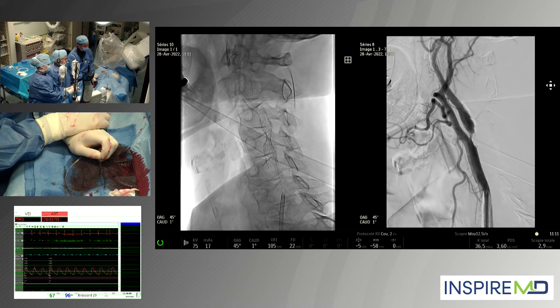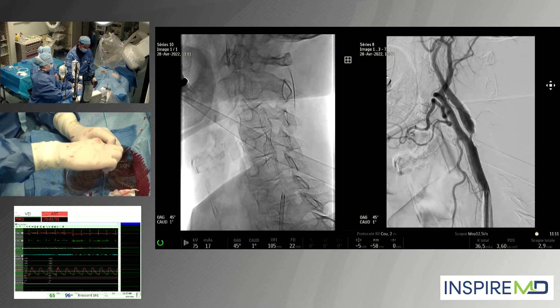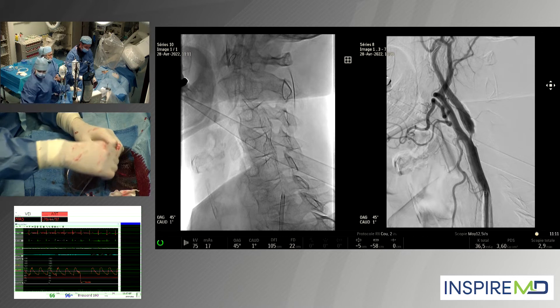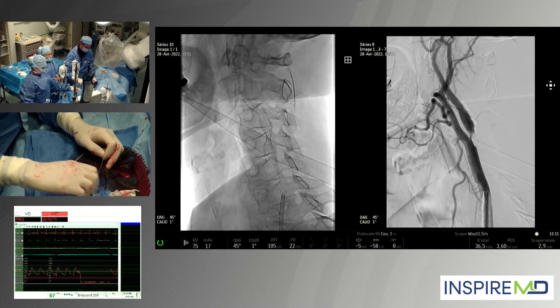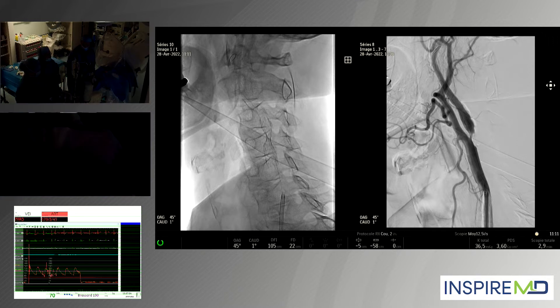We have a single shot. You can see the deployment of the stent. You still have a visible waist, so we have chosen a 5 by 5 millimeter balloon and we are going to post-dilate. The pressure is quite stable at 130.